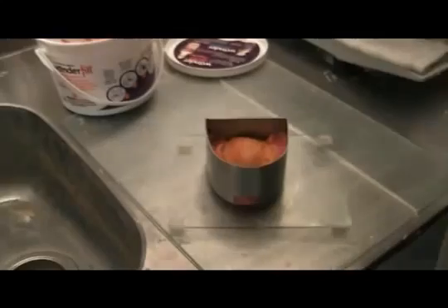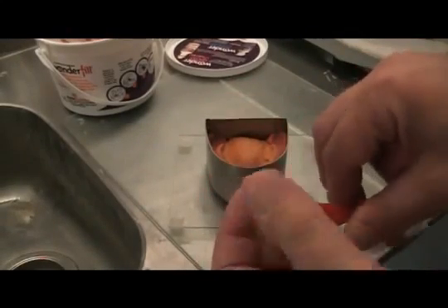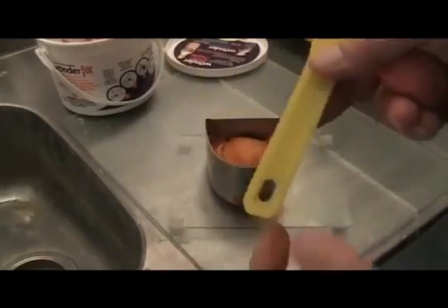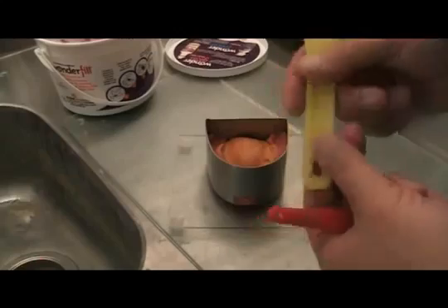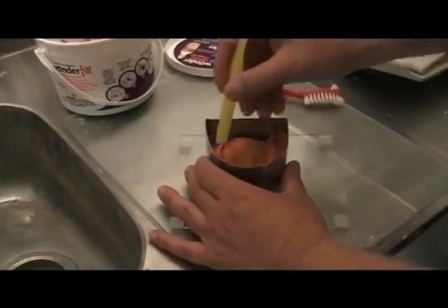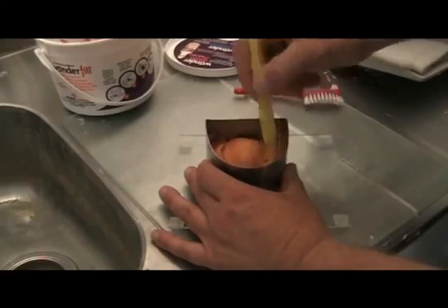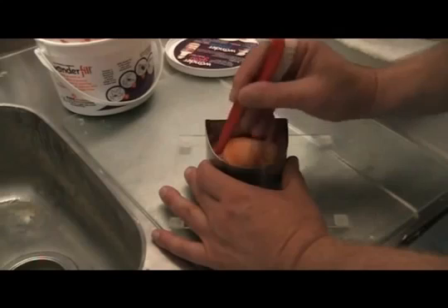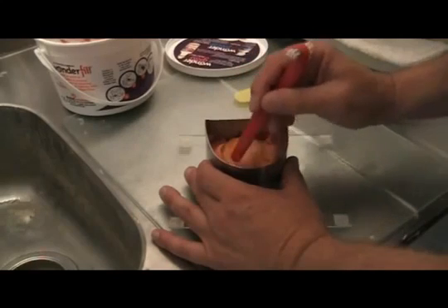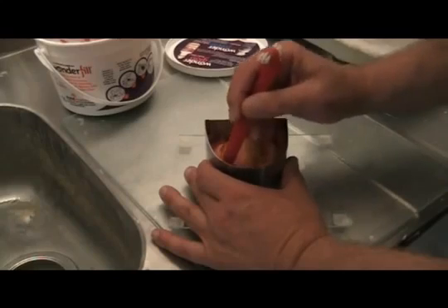That tool can be the handle of a denture brush, like this. It's kind of narrow and it's kind of rounded on the end. It could be the end of a spatula. It's flat there. Something to tamp the material down. So what I'm going to do next is take the handle and tamp my material down to that line that I drew on the impression. Okay, so let me just push that down really quickly just to show you.